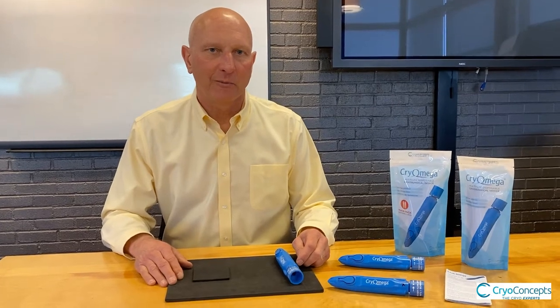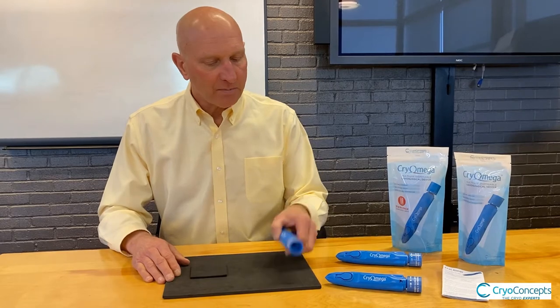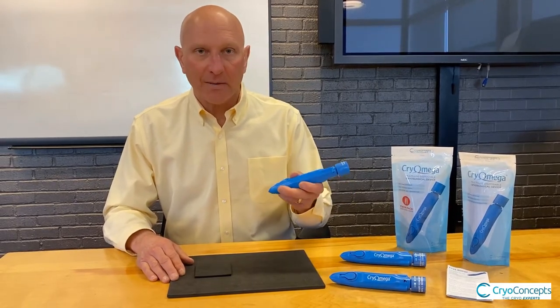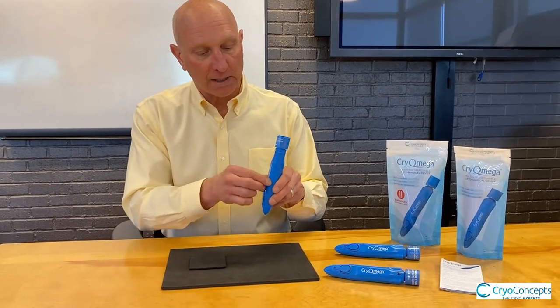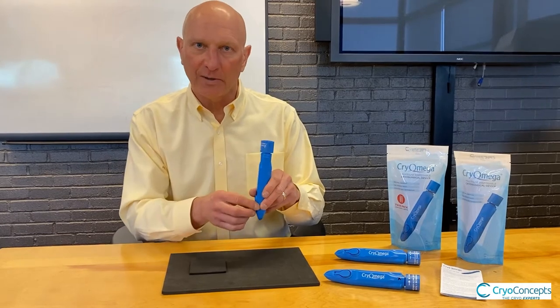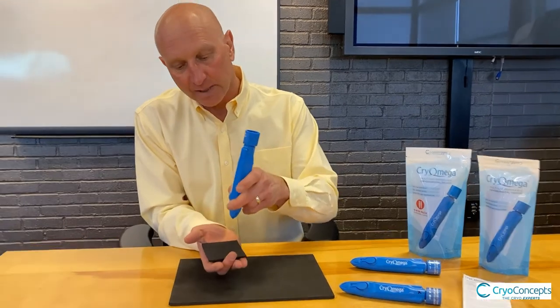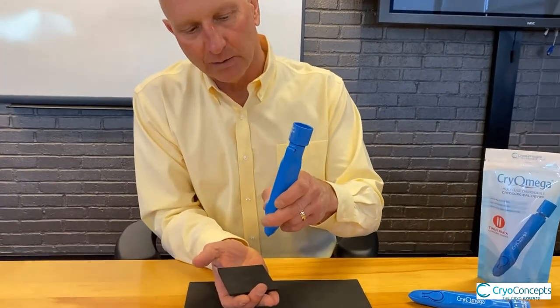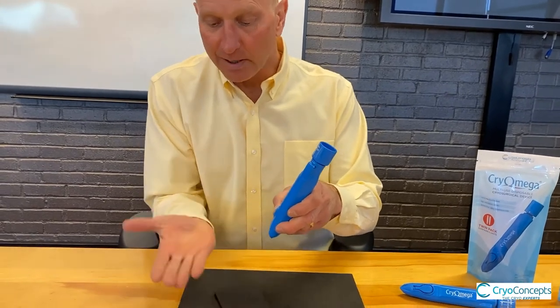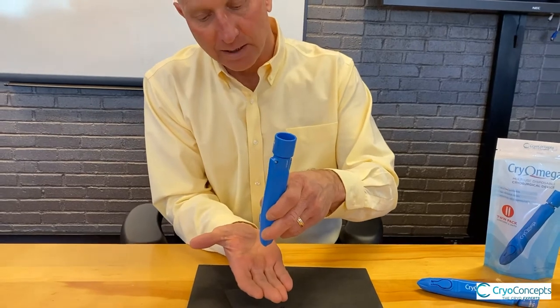In this next section, we'd like to give you an overview of some standard treatment protocols. You've activated your device and you're ready to use. Think about the Cryomega as a small container of liquid inside the unit that must always flow downhill. With the patient, you need to position them such that you're perpendicular to the surface to be treated when you apply the cryogen. I'm using a small practice pad as an example, but if there were a wart on the hand, this would be an ideal scenario.